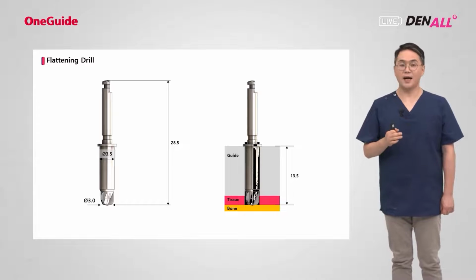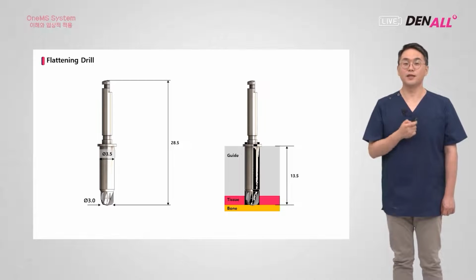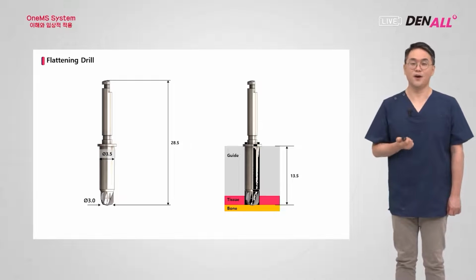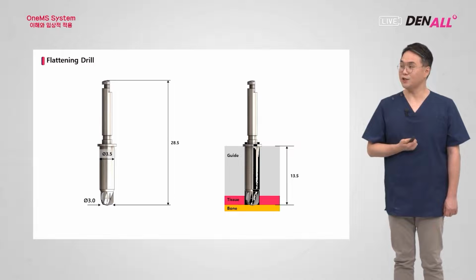And for sharp remaining bone or irregular crestal cortical bone, the flattening drill can be used to flatten them. And I explained about this in the OneGuide kit.